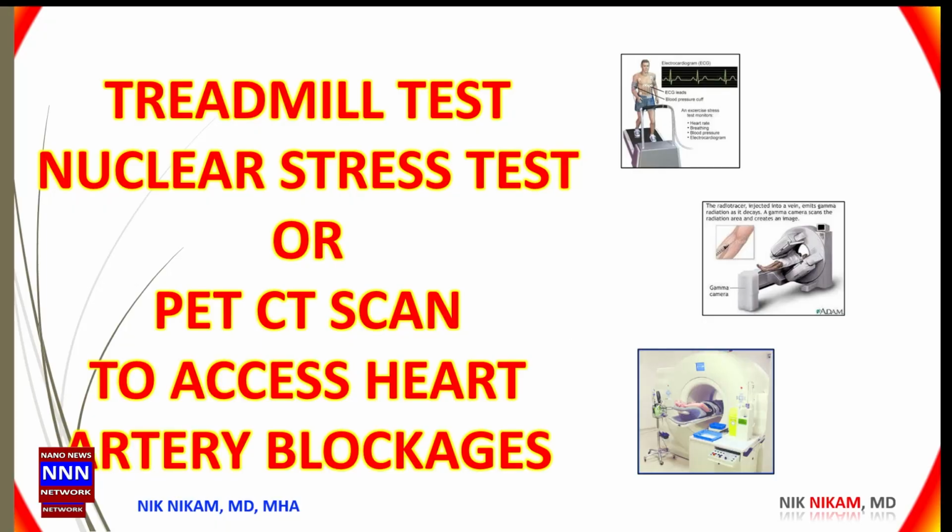There are various ways in which we determine the presence of a blockage or reduced circulation to the heart muscle, which is known as atherosclerosis. The simplest thing is a treadmill test. You can follow my arrow here. A treadmill test where we exercise people on the treadmill. We monitor their blood pressure, we monitor their heart rate, heart rhythm, and look for EKG changes during the exercise to see if there is reduced circulation to the heart muscle, and also look for symptoms or irregular heartbeats.